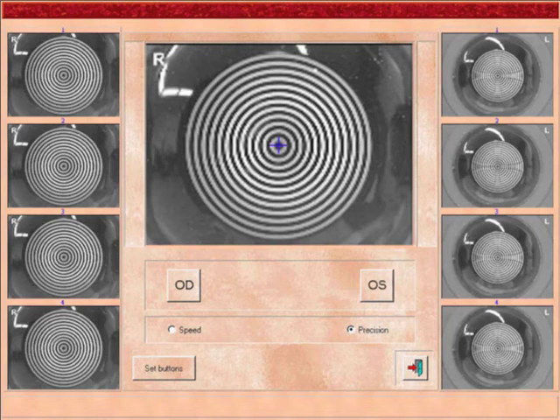They would actually take rulers and measure the distance between the rings for steel spheres of known radii, and created a kind of lookup table that said, okay, if the spacing of a ring is this number of millimeters on the photokeratoscope image, then that means 45 diopters at that point. So you could then take a photokeratoscope image and produce a quantitative map if you had a fellow who had an entire day to do it.